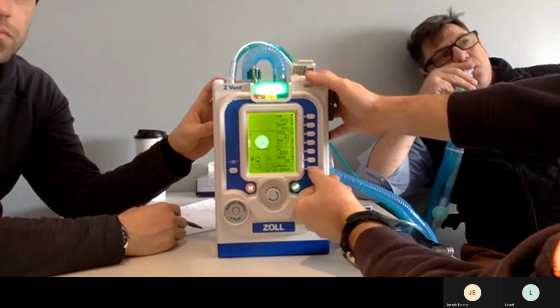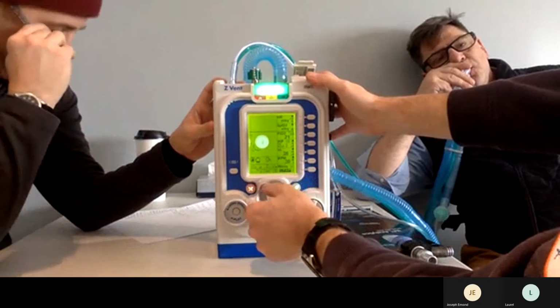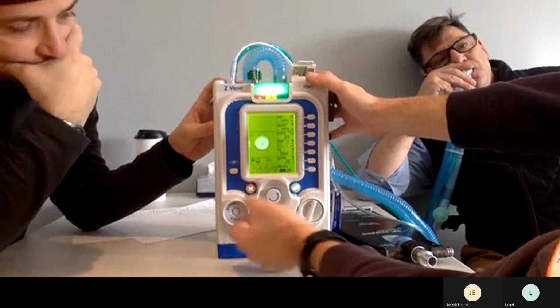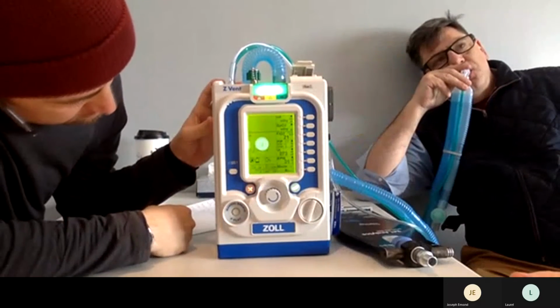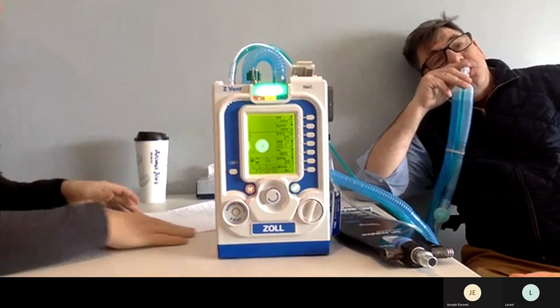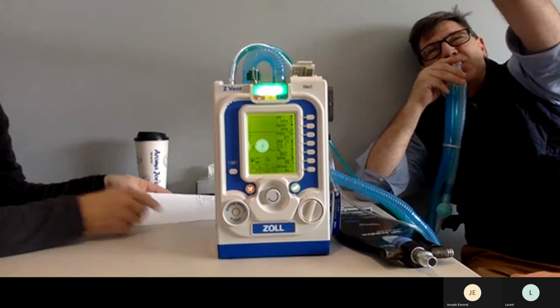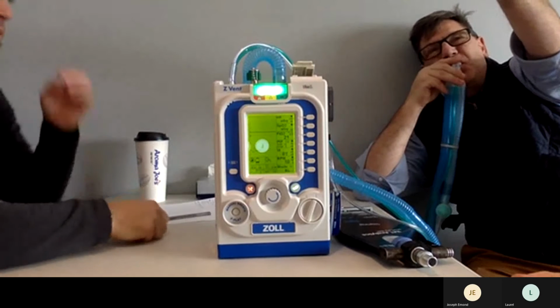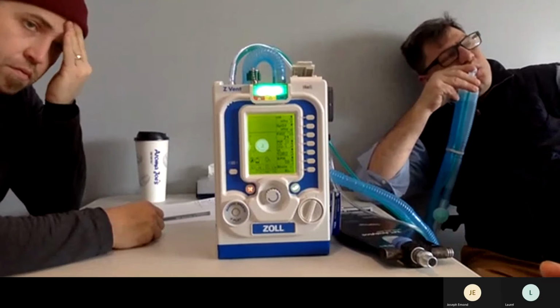And that's good. So then CPAP button, we can change it to BL. BL, there you go. Oh, so it automatically shifts up there in the peak. So this is true 13 over 9. That is right. 13 over 9.